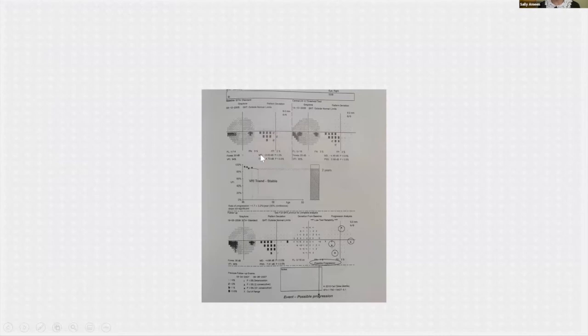And then again, you have to be a bit careful about, as with everything, people always say it's the quality of the data that goes in that will tell you how useful the information that comes out is. So if you don't have very reliable visual fields in the first instance, then this will be completely useless. So you just have to be careful about the selection of the visual field. And the machine does allow you to select appropriate visual fields.